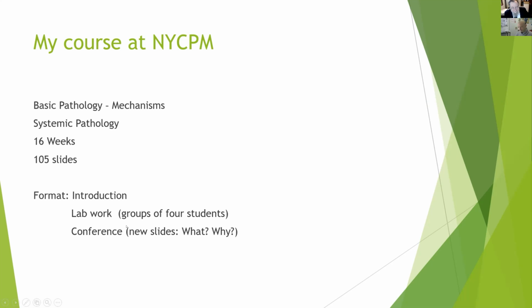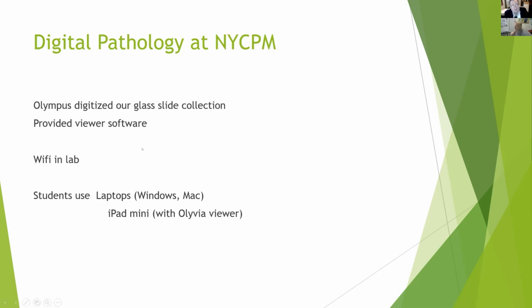And at the end, we would have a conference, put up some new slides, unidentified slides. What are you looking at? What's your evidence? Back and forth with the class until we reached a conclusion. For 30 years, I did this with microscopes and glass slides. Then the world changed over to virtual microscopy, to digital pathology. The Olympus company digitized our slide collection, provided viewer software. We had Wi-Fi capabilities in the lab, and the students used their laptops of various sorts, and iPad mini with appropriate viewers.